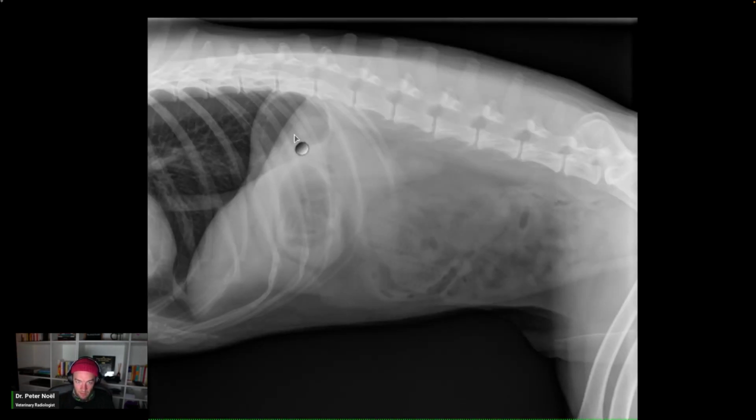Next, I go to the liver. That's fairly, it's not really parallel, but it's at least perpendicular and sort of between it. And this is pointy. This is all liver, okay? When you look at the liver, make sure the gallbladder doesn't have any gas in it. Make sure there's no mineral. Make sure this is nice and pointy so the liver is normal.